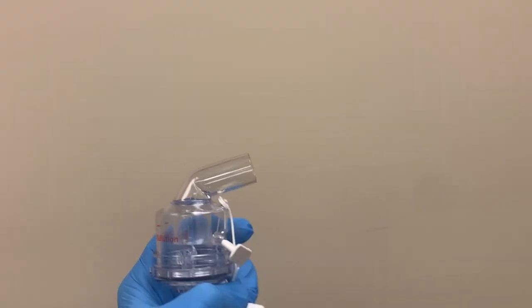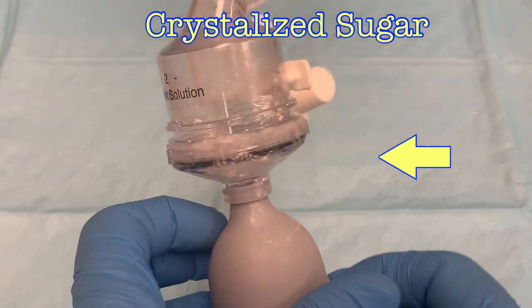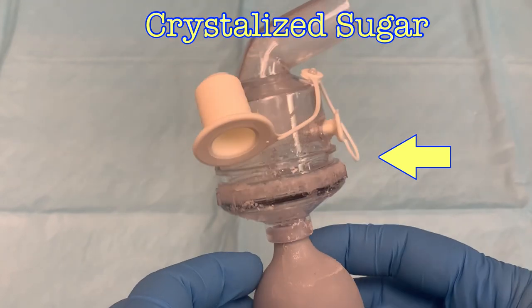If it still doesn't work and you feel resistance when squeezing the bulb, it's likely the tip is clogged with sugar. This happens more often with the fit test solution than the sensitivity solution. Always check the nebulizers before starting a fit test, but sometimes they may stop working during the fit testing process.